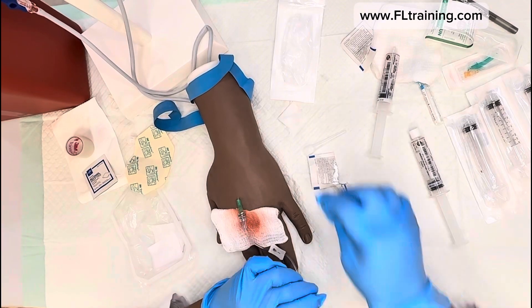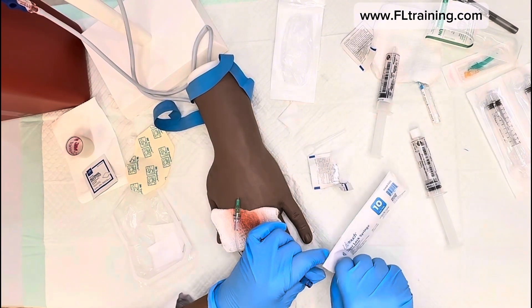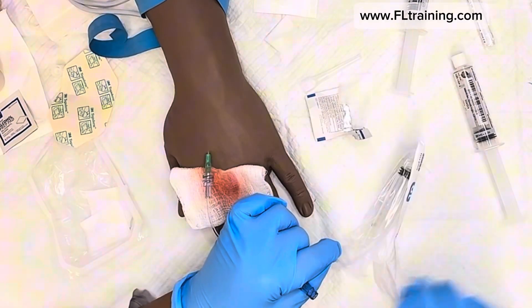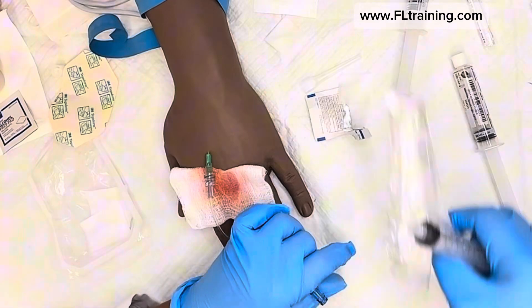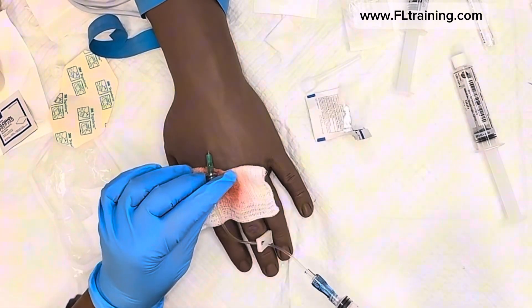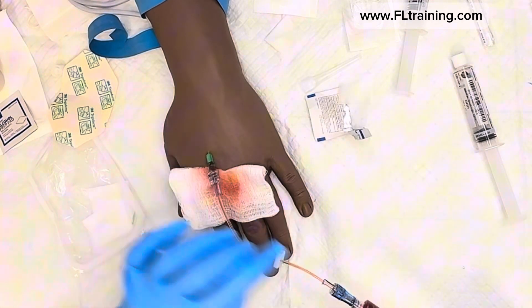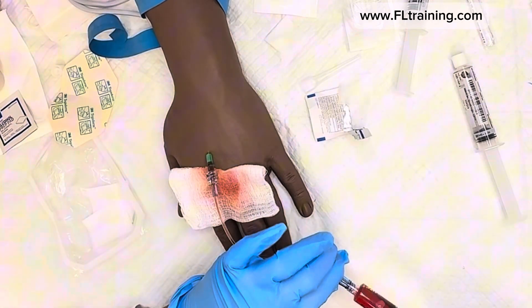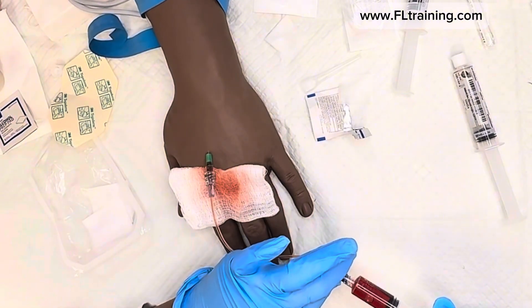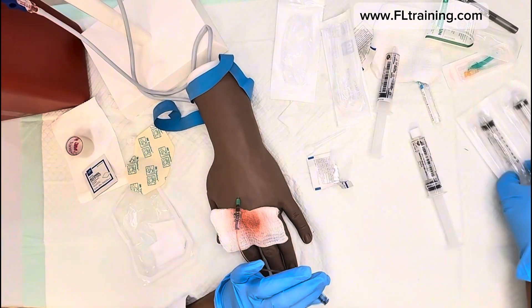I'm going to get a new alcohol pad. With this being a brand new IV, I'm going to quickly collect my specimen, then tape everything up. I'll pull back and aspirate — this first draw is not my specimen, it's waste, because I flushed with saline. If you send this to the lab it will be diluted.